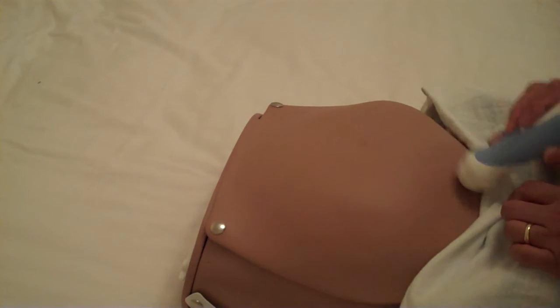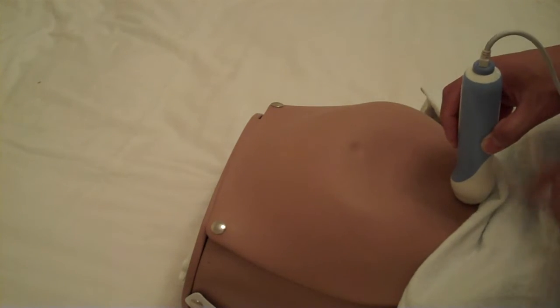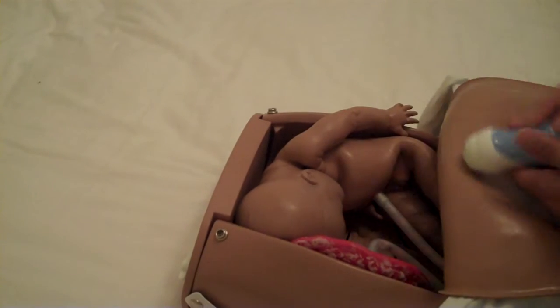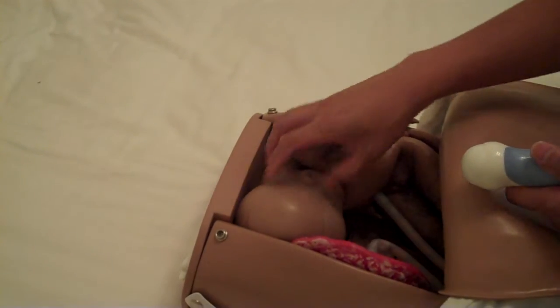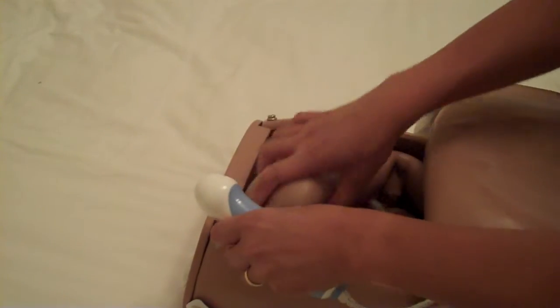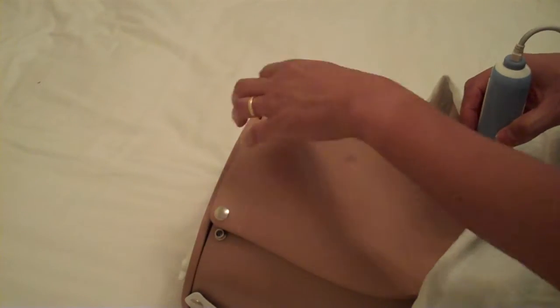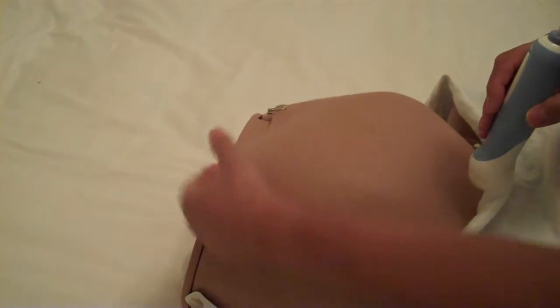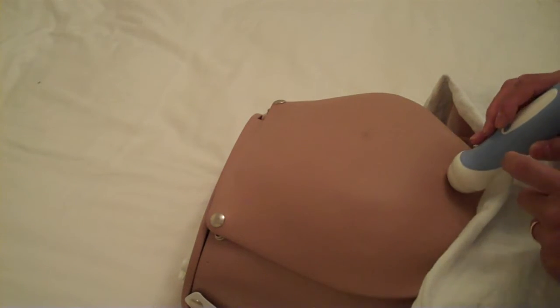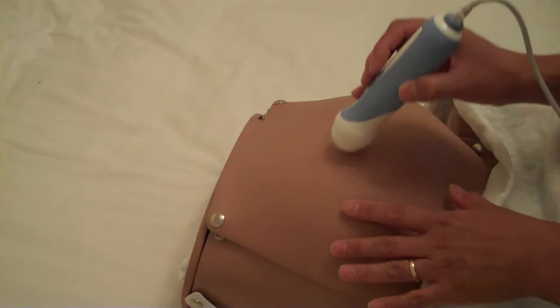So the initial scanning position is the midline down here, tilt, dot pointing up, and you're looking at the birth canal. But let's say, for example, if we open up this womb, this baby's head is up, so this is breech, and let's say the placenta is all the way up here, it's the fundal placenta. So if you look down here, you're not going to be able to see the placenta or the baby's head. So if you're interested in these other areas, all you have to do is move the probe, move and tilt, just find the thing you're looking for.